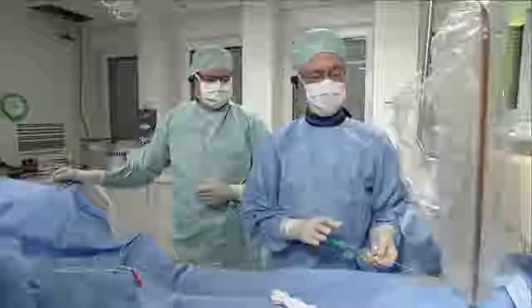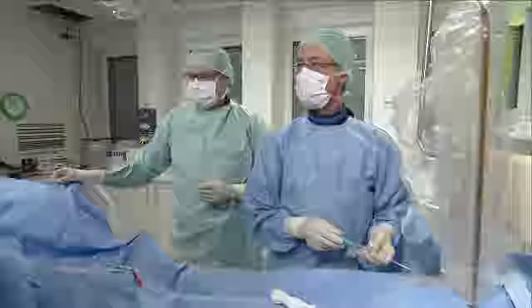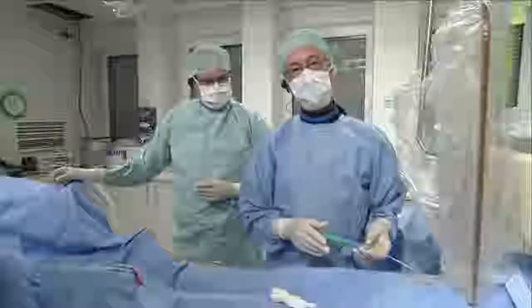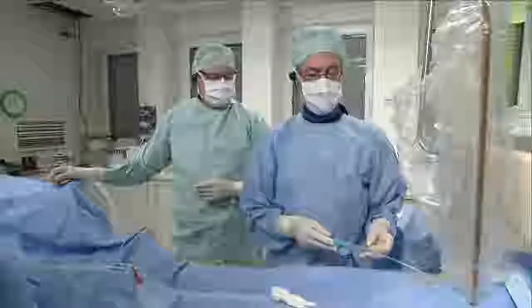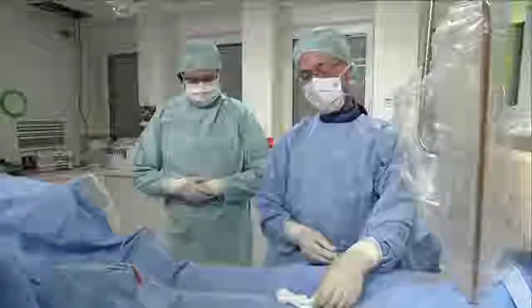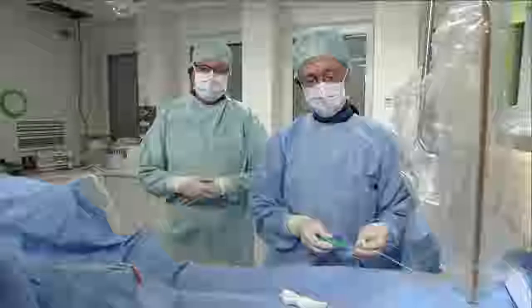So I have a 6 French sheath in the groin, in the femoral vein. Bushra and Bojan are just doing some measurements. Horst, did you use ultrasound-guided access or the normal way for you? Well, that's actually a good question, because usually everybody thinks venous puncture is easy, but it's not always. And here it was quite difficult, and Julia was about to go and bring the echo machine for the ultrasound-guided puncture, but finally I made it. So it's not always that trivial. Especially if you are a coronary guy, then it may be difficult.